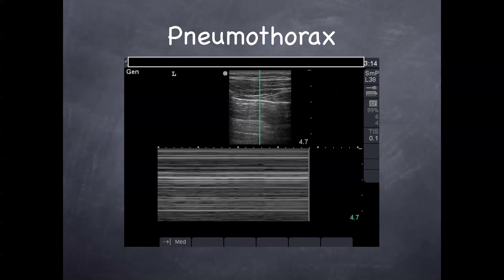This is a pneumothorax on M mode. As you can see, the beach is gone and it's filled up with what's called a barcode sign. There's no differentiation at the pleural line to suggest any remnant of lung sliding. This is an abnormal picture and should lead you to think this is a pneumothorax.